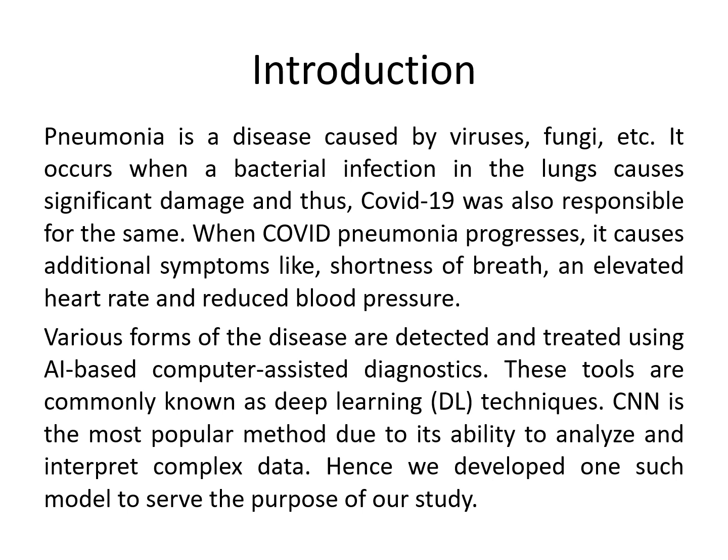As we all know, the COVID-19 virus can affect your lungs, causing pneumonia, where the virus infects the airways, and to fight off this infection, the immune system causes inflammation. While most people under 60 eventually survive pneumonia with safety measures, the mortality rate is 31% for those above 60. The proposed method is tested on a standard PC with Windows 10, 64-bit, any CPU, GPU, and Google Colab notebook.